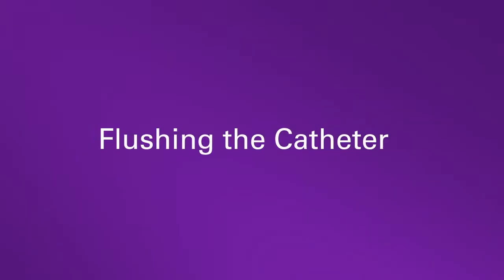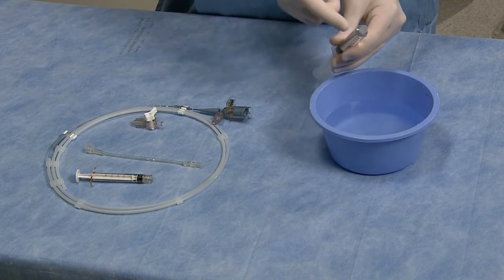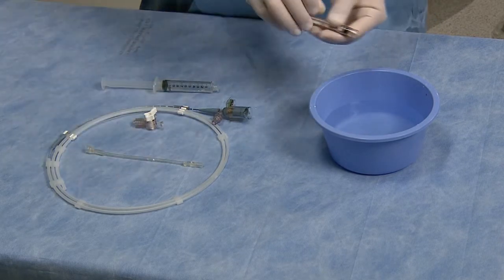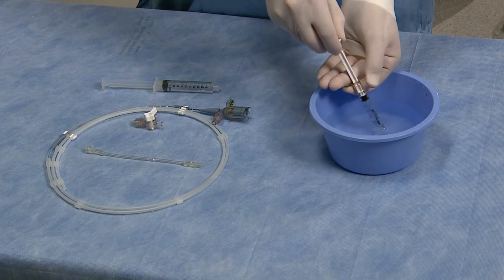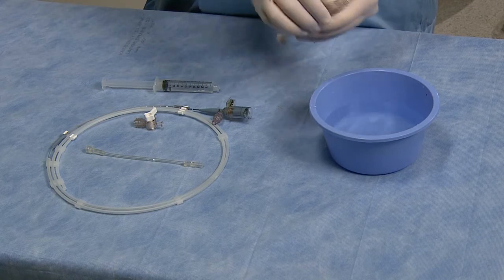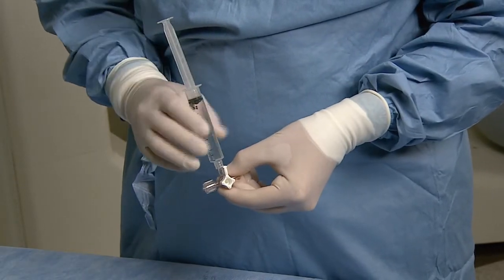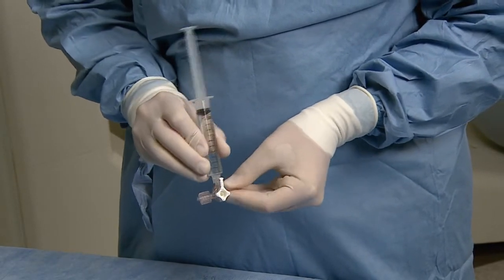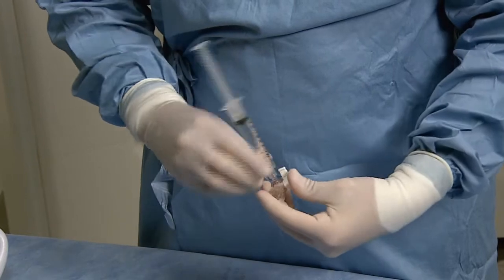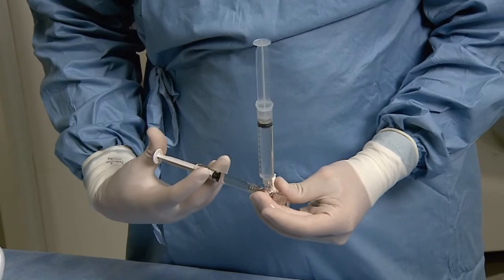Fill both the 10cc and 3cc syringes with heparinized saline, making sure all air is expelled from the syringes. Attach the 10cc syringe to the 12 o'clock position of the stopcock and the 3cc syringe to the 3 o'clock position using the wet connect technique.